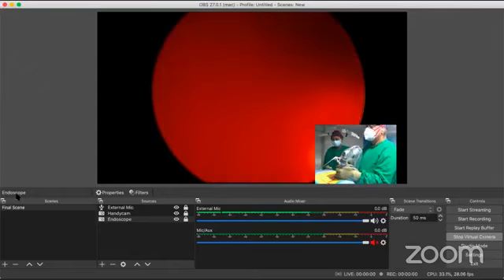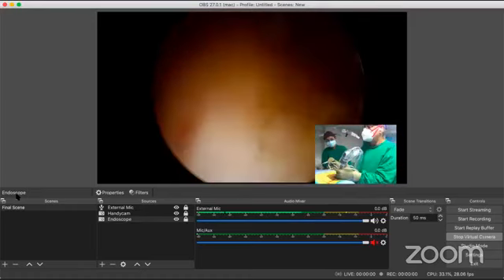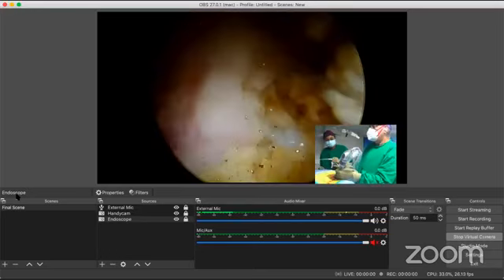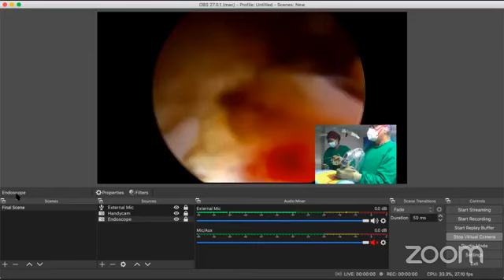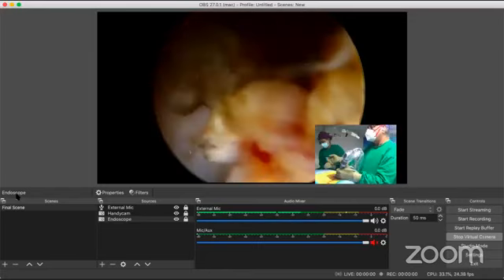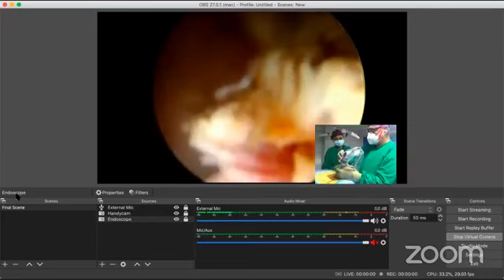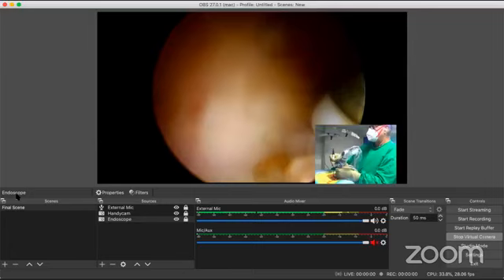Sir, मला bleeding control करा, please. BP किती आहे? Huh? छोटे oozers are troubling me. Fire blue, please.